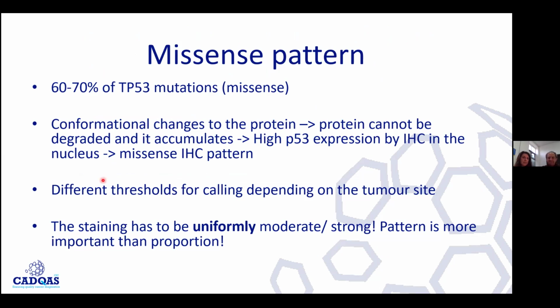Yeah, so this is just the explanation of what Corrado was saying before, that this is one of the reasons it was thought that this is the accumulation of P53, which does bad things for the cell, but is in fact the usually non-functional or poorly functioning protein that accumulates in the nucleus. And we see this pattern. You can understand the conundrum for the scientist that looked at a putative oncogene of some kind which accumulates in tumor. How can I call it a tumor suppressor?